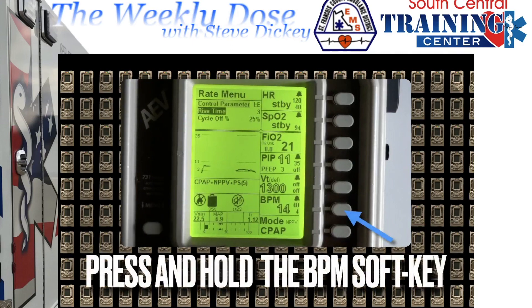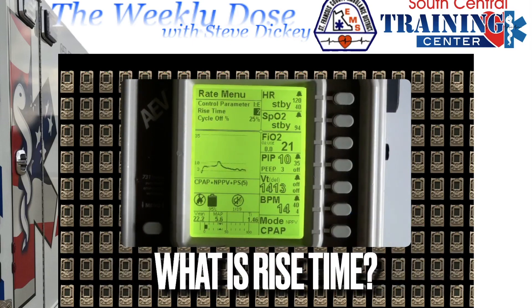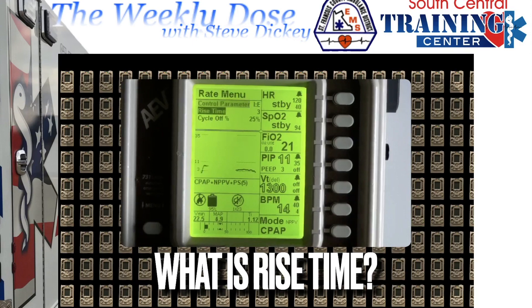To find rise time, press and hold the breath-per-minute button. Rise time is the length of time that the vent will assist with that breath. The shorter the rise time — the lower the number — the quicker it will provide that inspiratory breath assistance. The longer the rise time — the bigger the number — the slower the inspiratory breath.